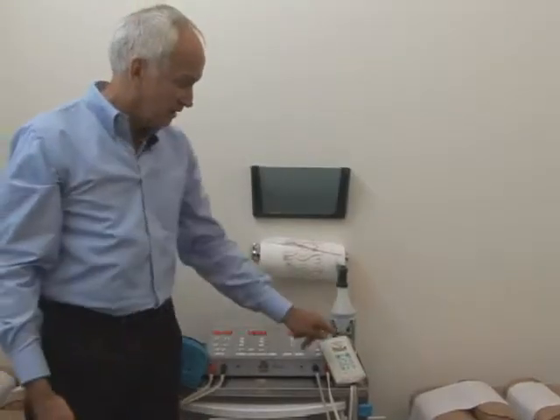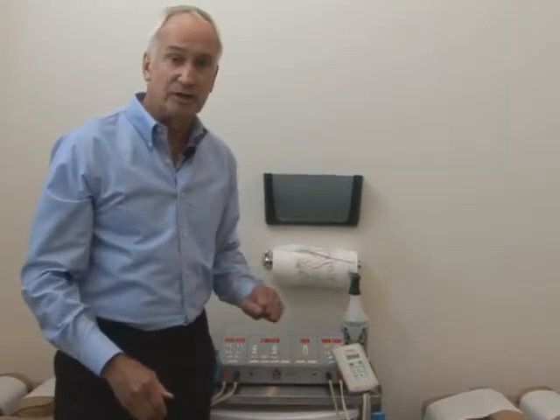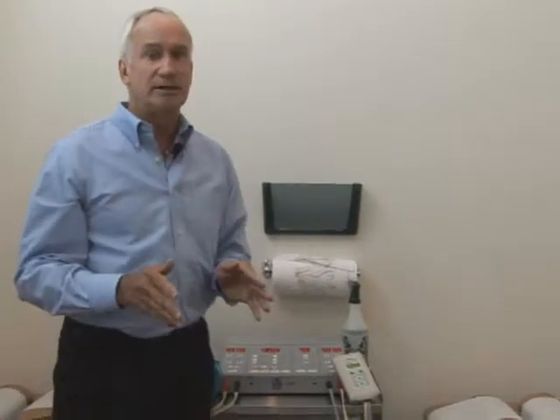Now all we do is the patient can do the exact same thing, except they can do it at home or at work or even when traveling in a car. Because when you feel the pain starting, you can then self-treat.